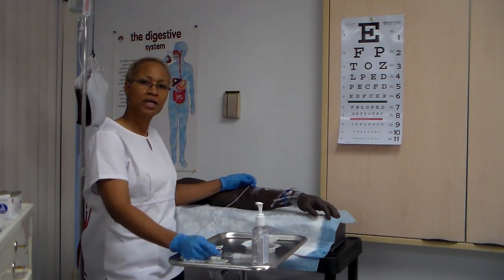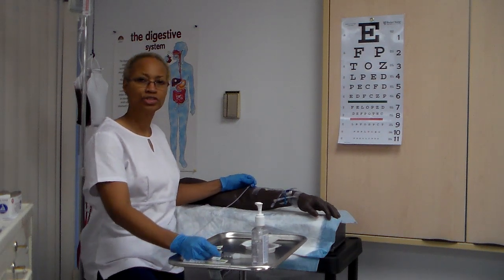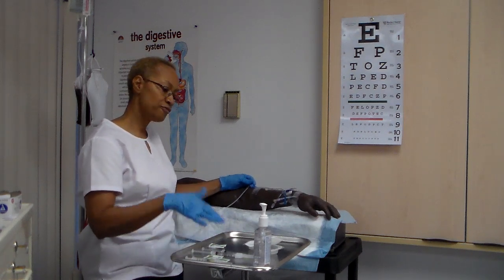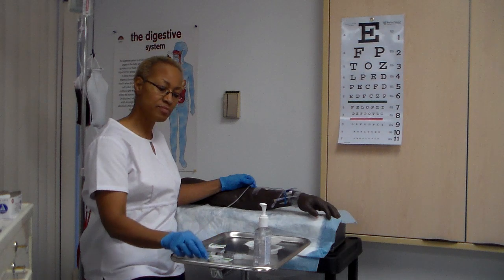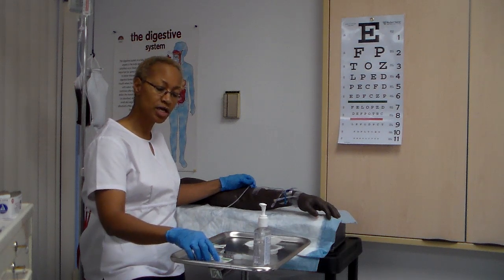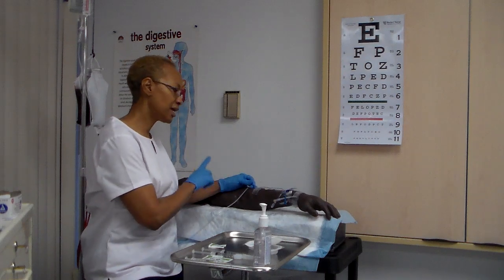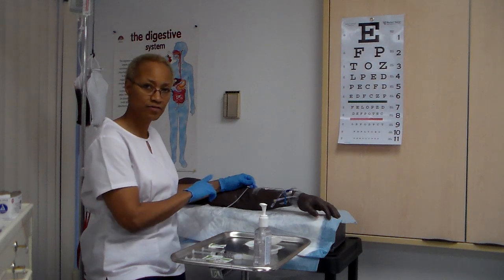Okay, so now with some medications, it needs to be pushed slowly because it's an irritant. So if I know that I'm administering an irritating drug, I want to make sure that I deliver that medication very slowly. And it may be delivered over a minute or over 2 minutes. So you should stand there and you should time that medication delivery. So yes, always have on your watch.